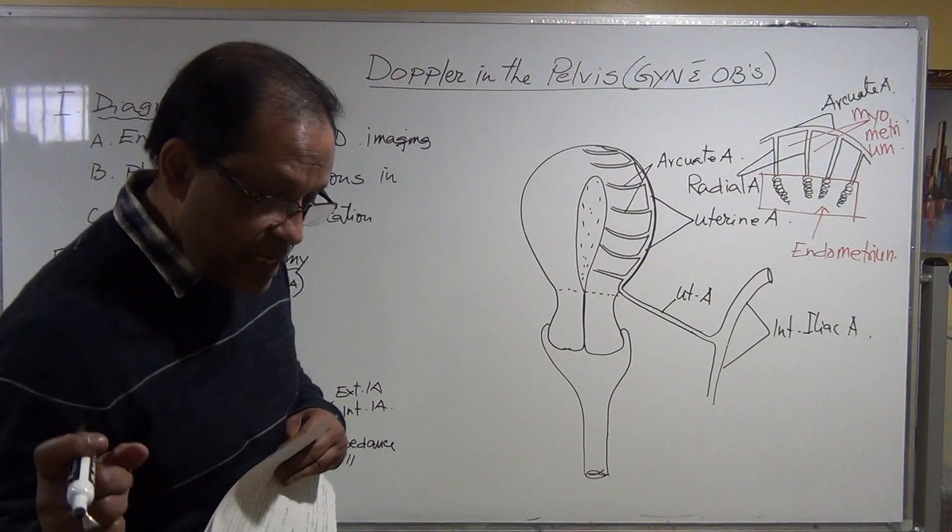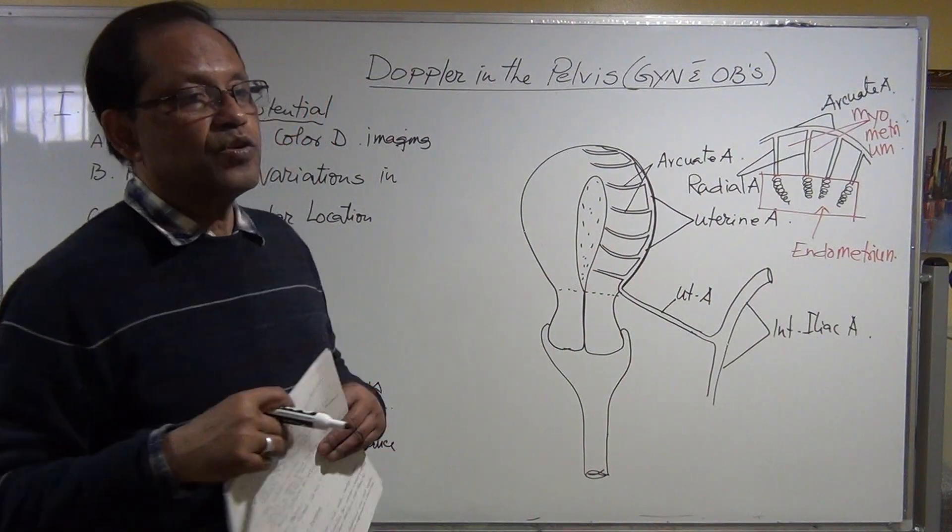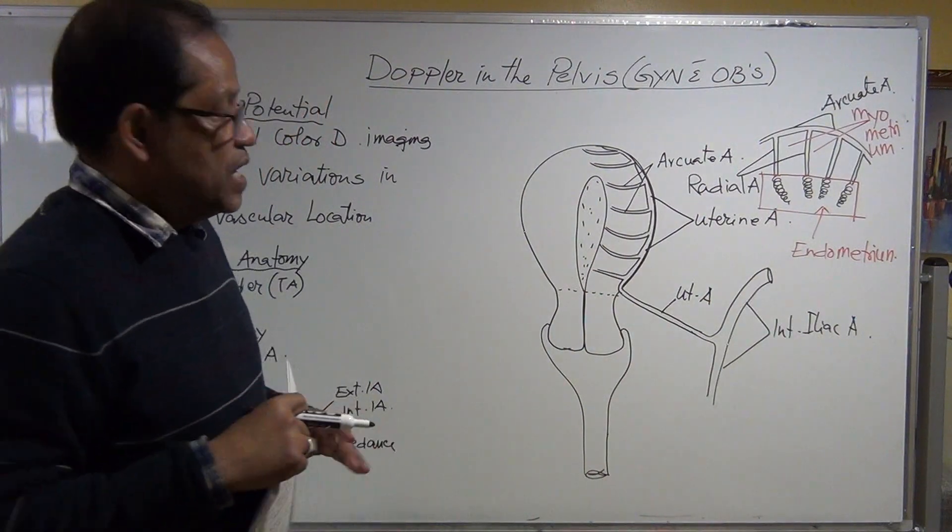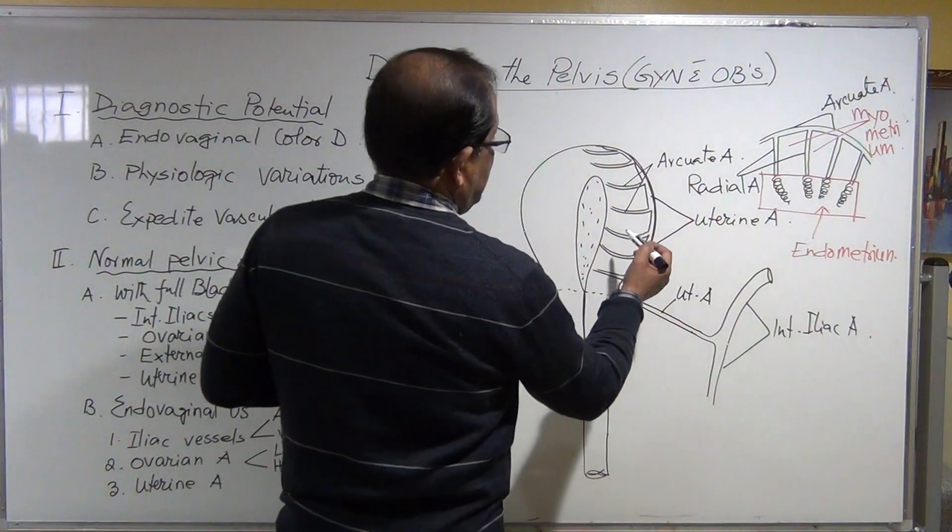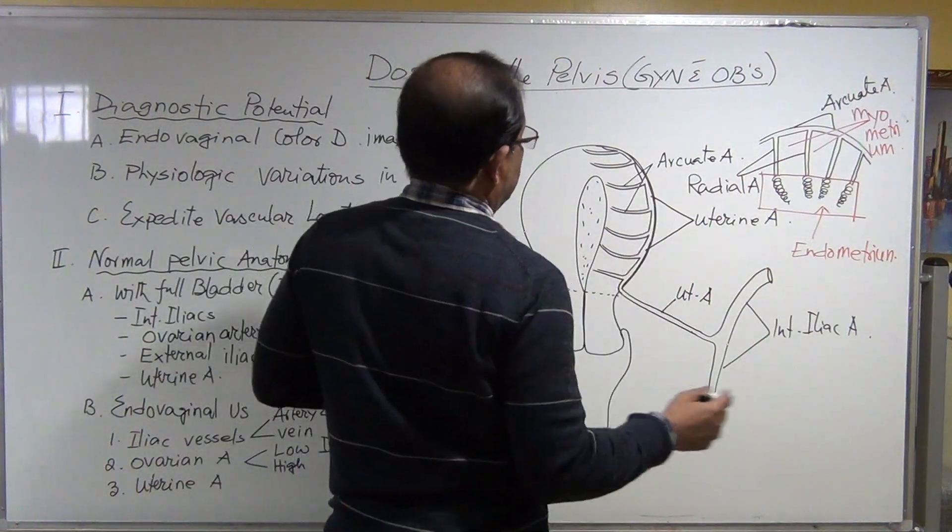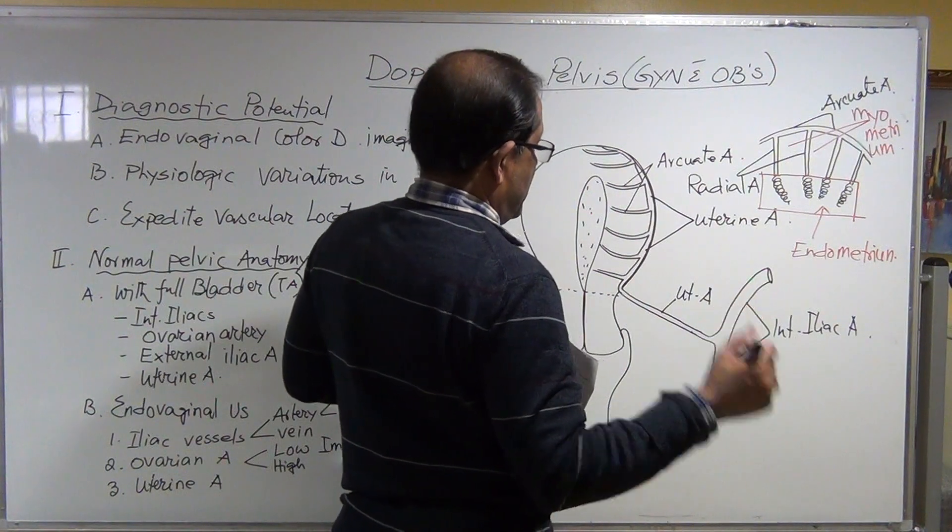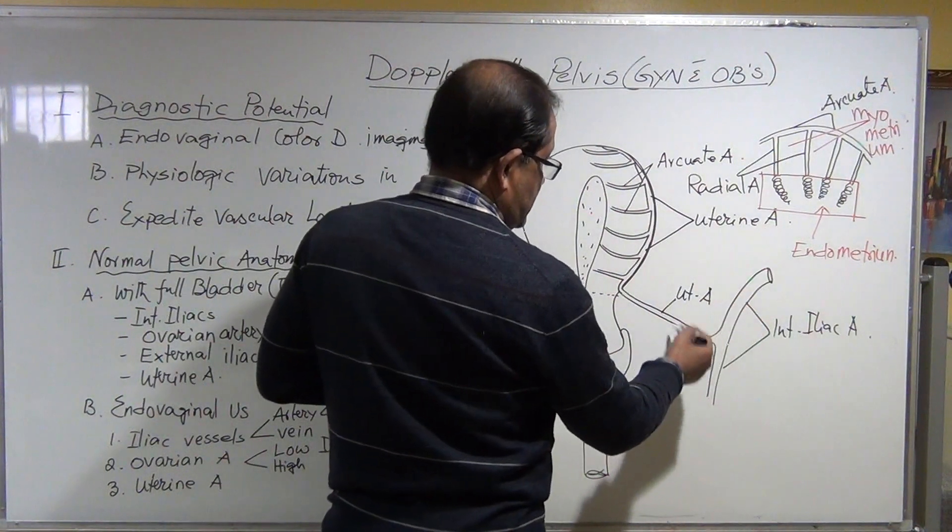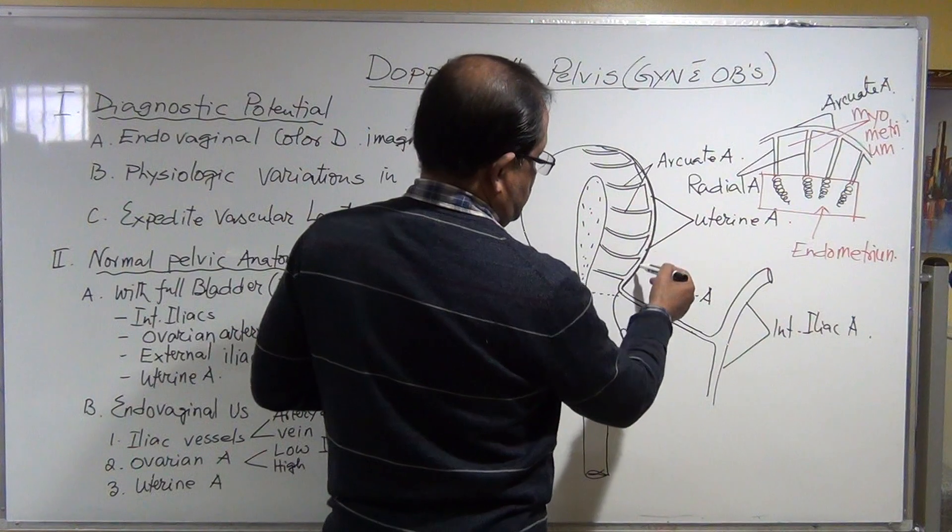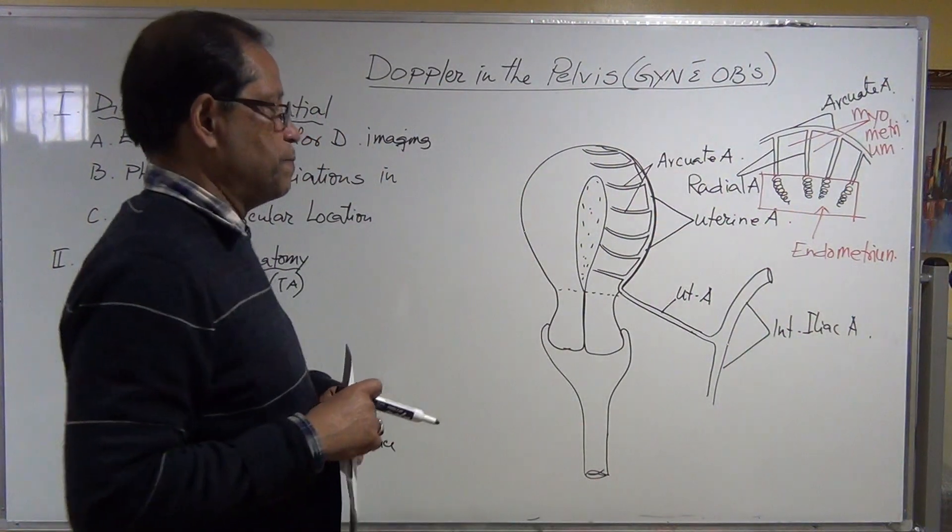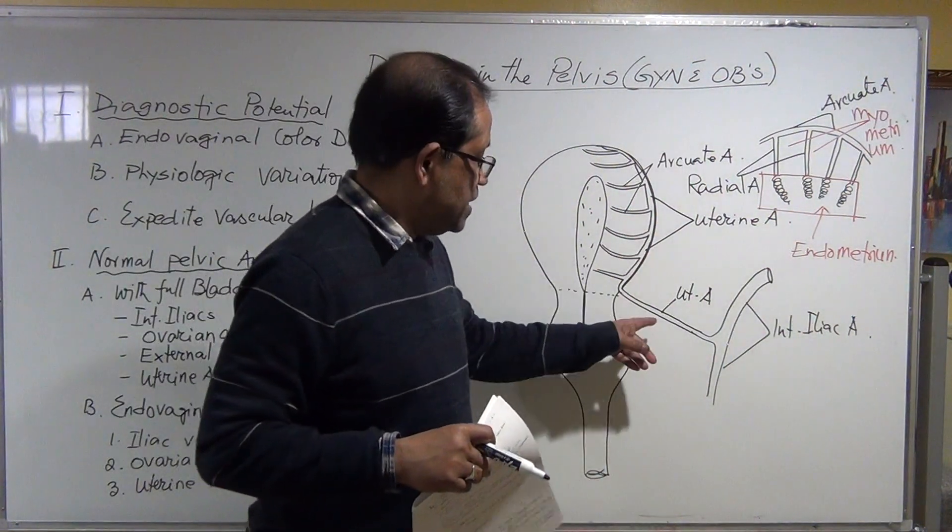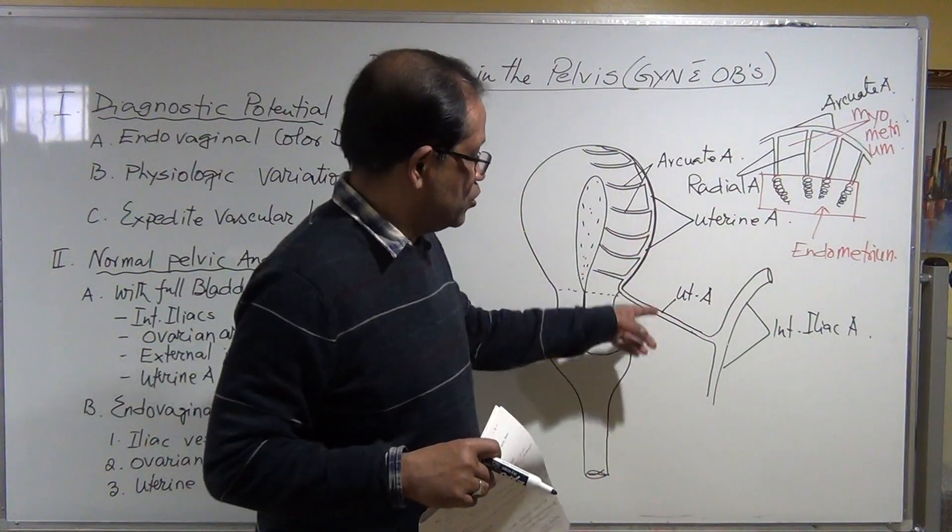It has to be transvaginal ultrasonography to see the arcuate artery. Even the radial artery, you have to use transvaginal approach. But uterine artery, this uterine artery and this uterine artery, you can identify and do the Doppler in transabdominal too.